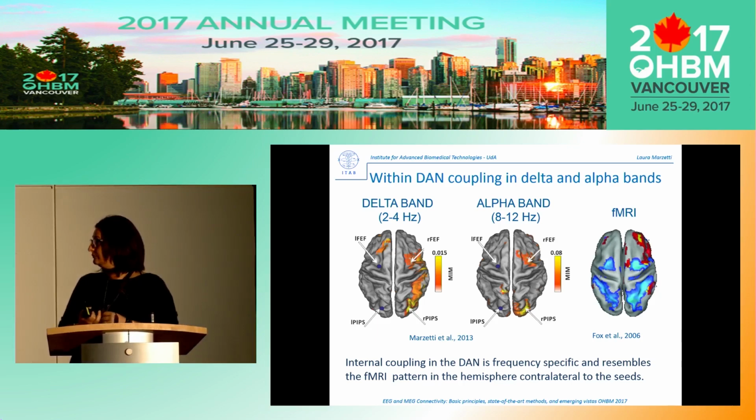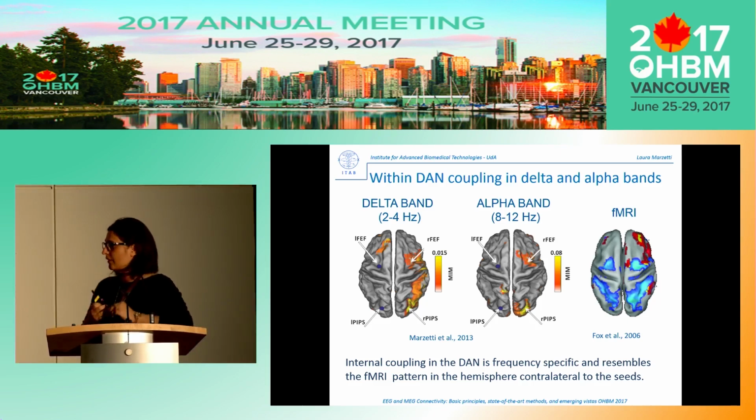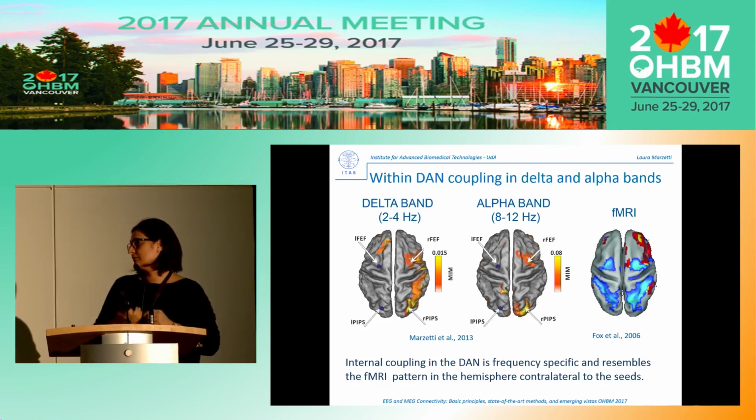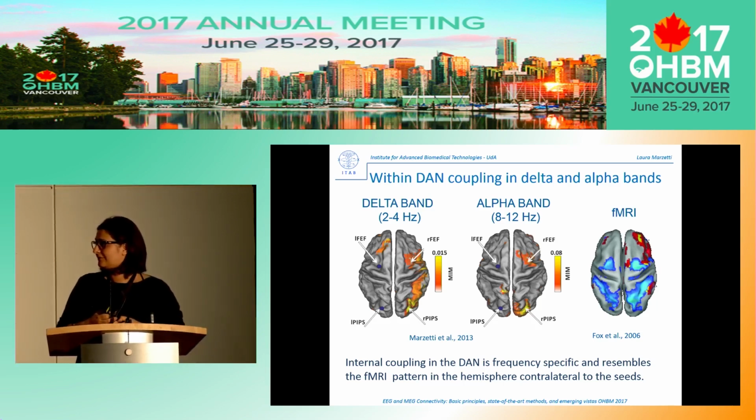There's another point to make on what you said, to open up this discussion a bit. When you have simultaneous recordings of EEG and fMRI, and you do the spectral correlates of the resting state networks, using the resting state network fluctuations as a regressor for the EEG power spectrum, you see that the spatial distribution of these correlates varies by frequency. That tells you that the different subsystems of these resting state networks must have different frequency distributions, with some frequency-specific signatures. That makes these resting state networks quite complicated in terms of how they interact in terms of oscillations or frequencies, and that's a puzzle that we still have to solve.